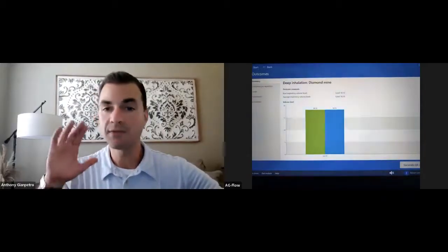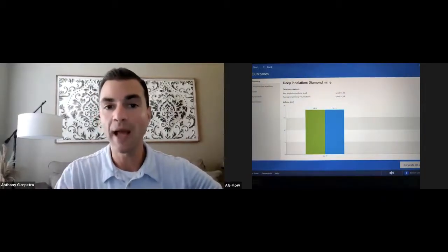On the bottom, that stalagmite, 2 to 6 is what I want you to think of from the top of the screen down. But as you get closer to 2, it's harder because the stalagmite is taller. And then vice versa. 6 is easier, which is pretty much where this activity is set at here. It gets a little confusing, but when you use it a couple of times, it's very intuitive. You'll understand what I mean by all this.